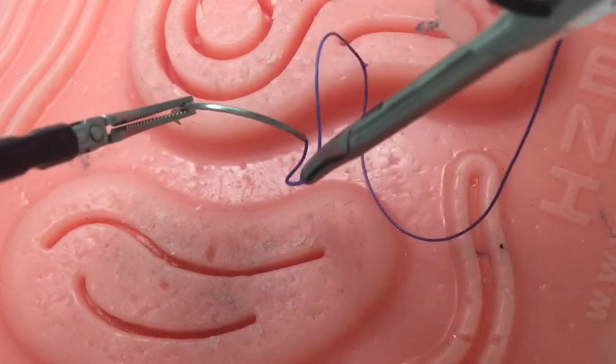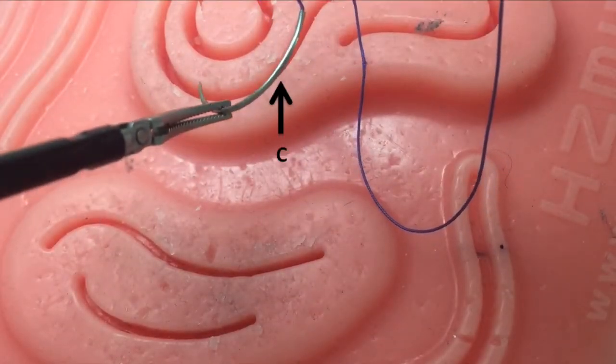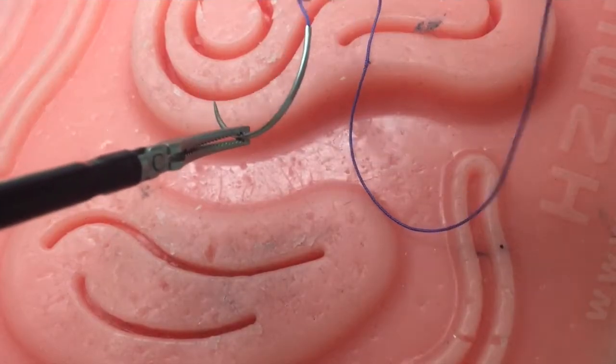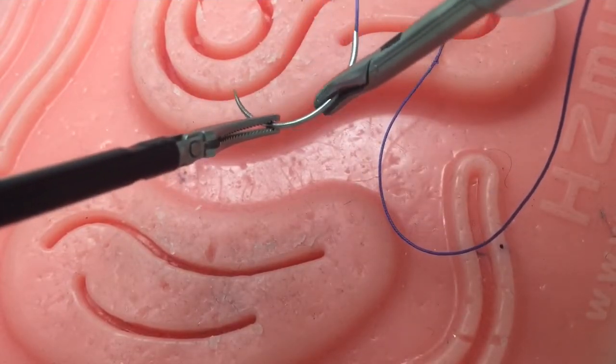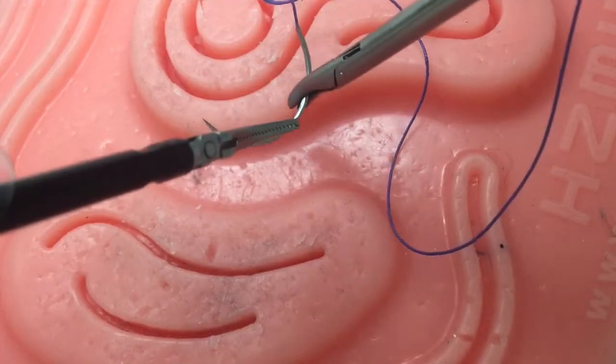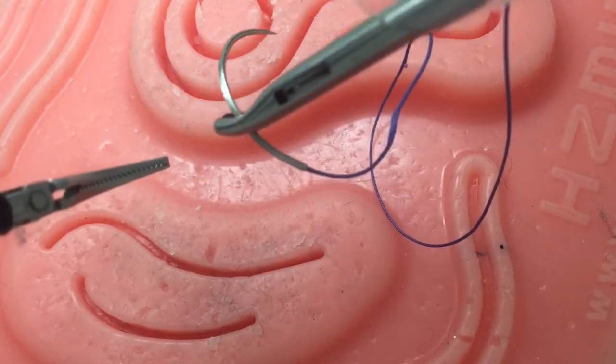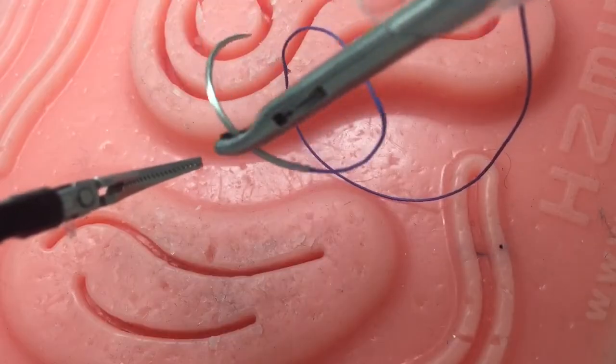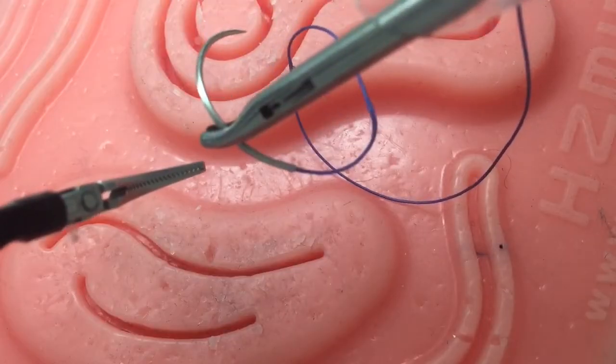Needle Loading. Swivel the needle such that the light evenly reflects off point C. Then, using the needle driver, grasp the needle firmly at point C. Release the needle from your left instrument and do a couple practice throws to ensure the needle was loaded approximately 90 degrees to the driver.